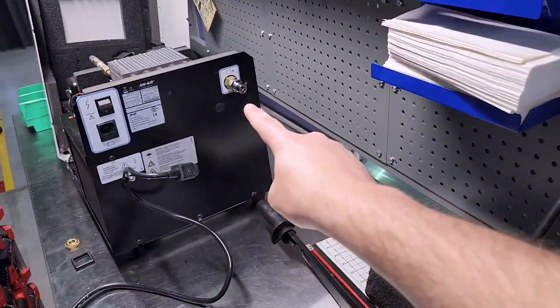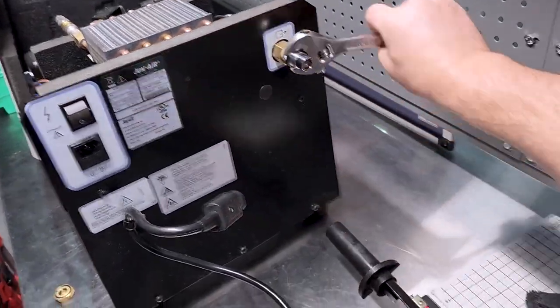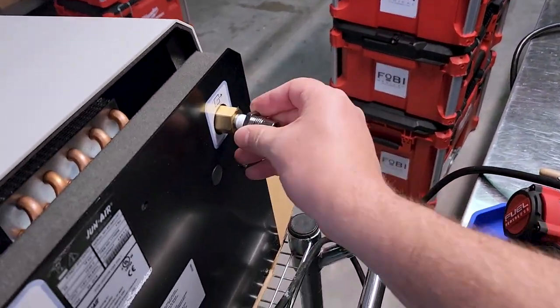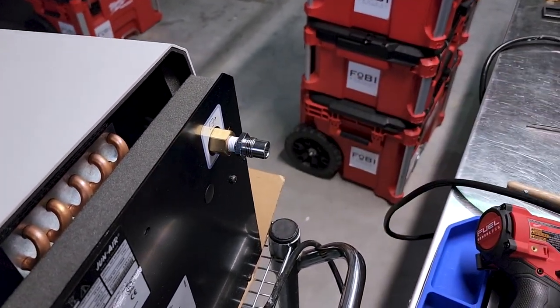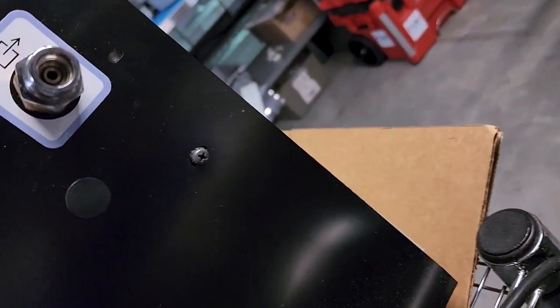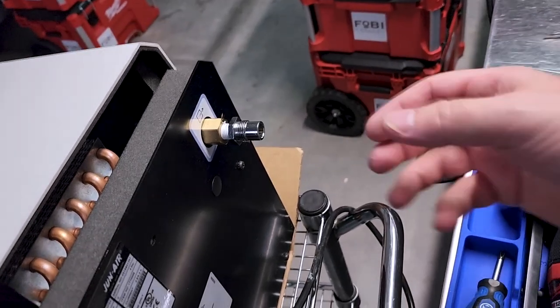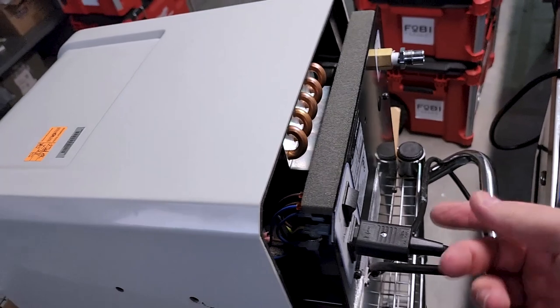Let's see. Now I got my doohickey over in this guy. Hold on. There we go. So with compressors, you have to occlude the output in order to test them out, because it's a compressor. It compresses things. They don't operate based on flow. They operate based on their pressure capabilities. So what I have here is a little fitting that has a little leak stop. So it has to have a male fitting to go in there to open it up. So it's basically an occluded fitting. So now I can see pressure.